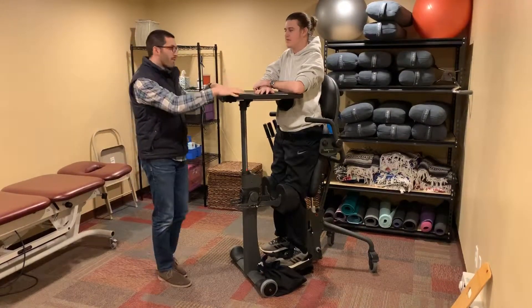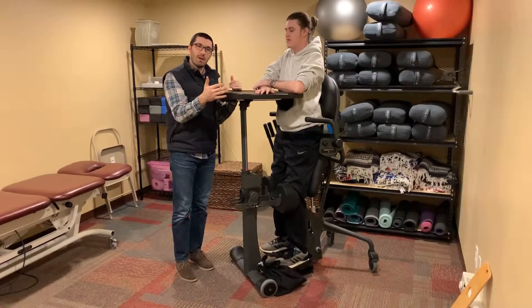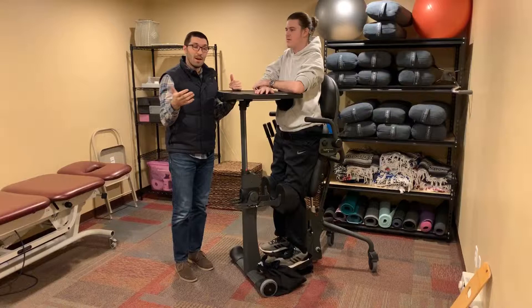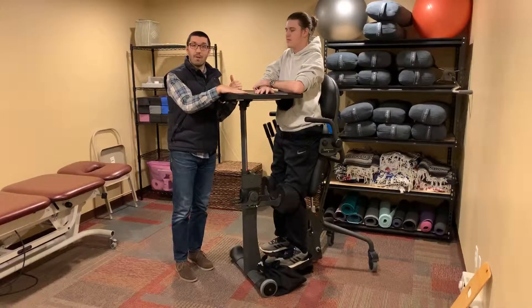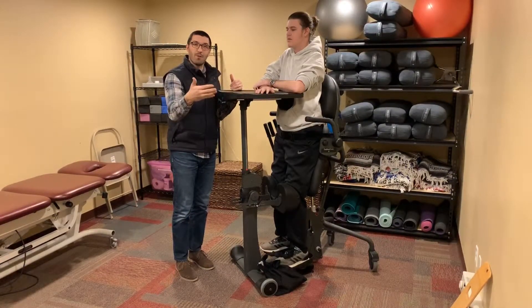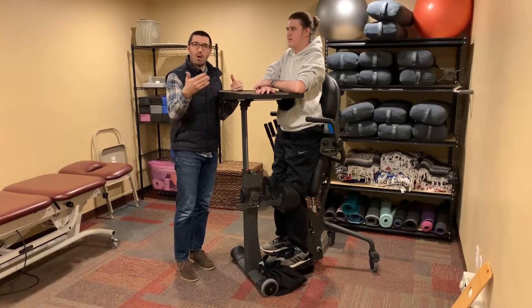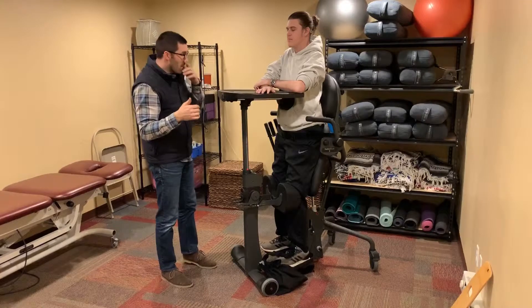These standing frames have a lot of adjustability to them and there are lots of different components that you can get as part of this. You need to make sure that the therapist you're working with has trialed you with some of those components, or that you're at least knowledgeable in what components are out there.